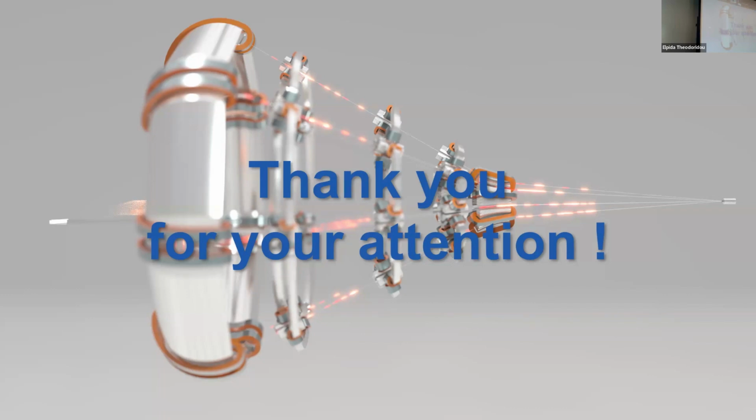So basically, if you have 10 to the 10 protons out of your machine, you can deliver all the 10 to the 10 protons. There are no limitations in the gantry. Yes, sir.